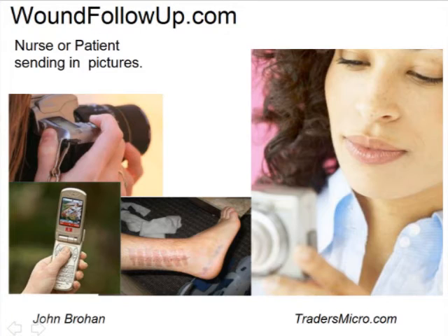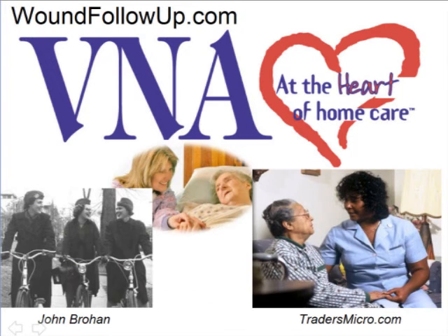Now to the other side, sending in pictures. Take the picture with the camera you have. It's the conversation between the wound care nurse and the person caring for the patient that is important. Send in 2 or 3 if you like. Visiting nurses use this system to record the progress of their patients and to familiarize themselves with new ones.